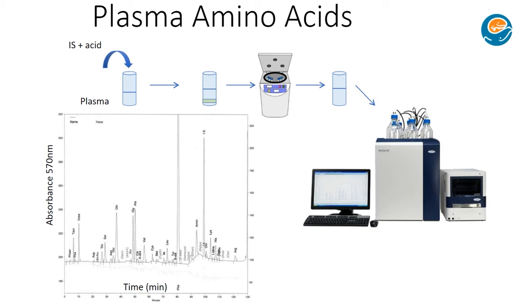There are ways to speed up the chromatography and target particular sections, and that does have its uses for specific known diagnoses. But generally, it takes about 3 hours start to finish. We run one patient at a time. So this is not the fastest technology, but again, there's a level of robustness here and reliability that's really fantastic.